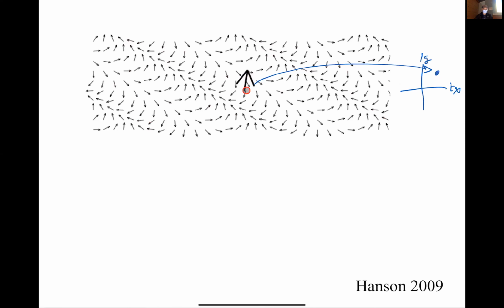So for example, because it's uniform, this spin cancels out the contribution of this spin. For every spin, you can find another spin that's sort of equal and opposite, because I've got all these uniform variations here, and the object is uniform. Okay. So it makes sense that a lot of things cancel out, so we're not going to get a very big value here.